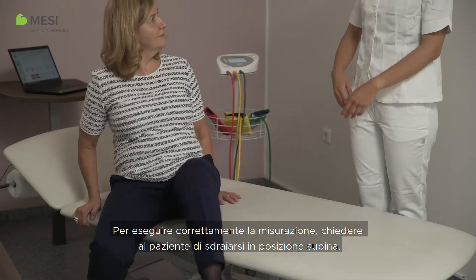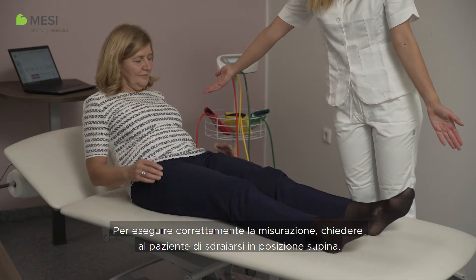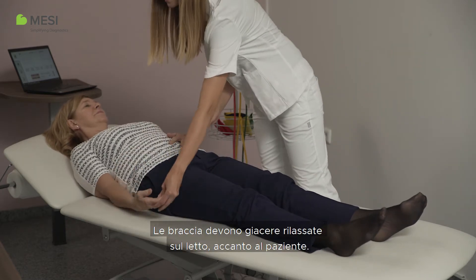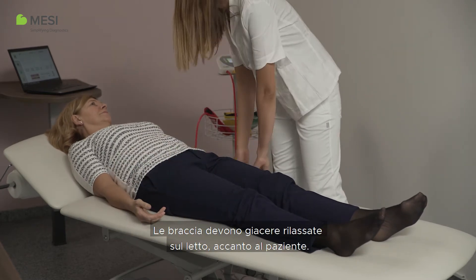For the measurement to be correctly performed, ask the patient to lie in a supine position. The arms must lie relaxed on the bed beside the patient.